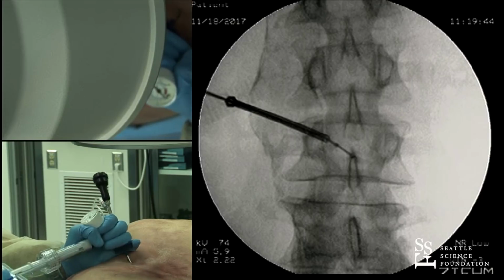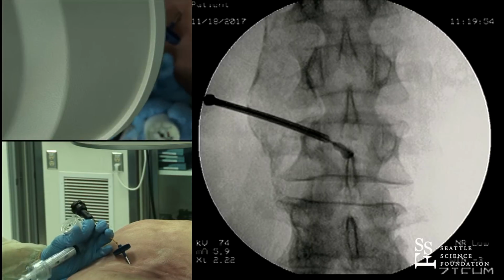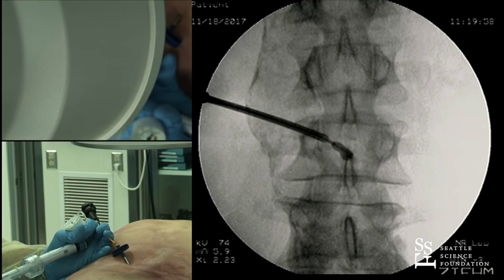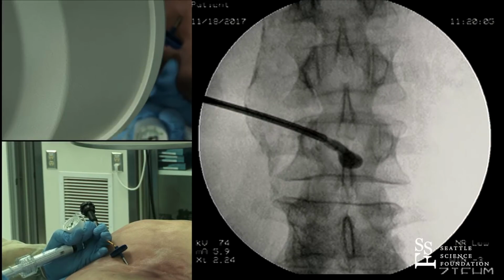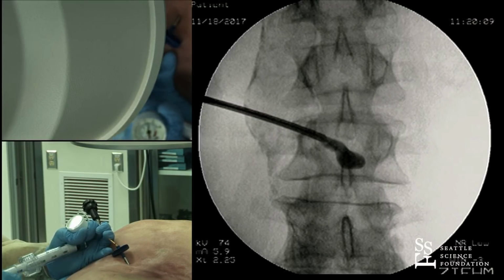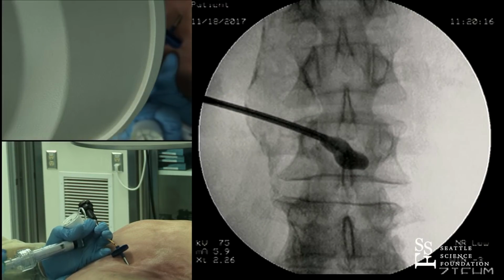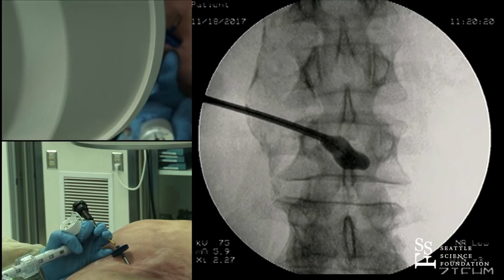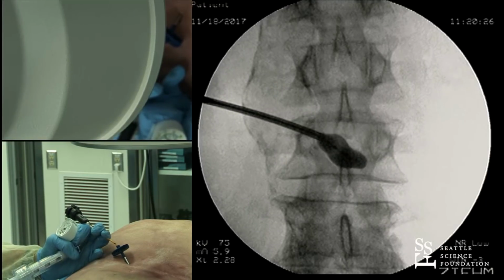And whenever you do this, you'll have to hold the balloon so it won't slip forward on you, the so-called watermelon seed type of occurrence whenever this thing blows up, and we'll get more of an inflation in the center of the vertebral body. Keep in mind, you don't have to blow the balloon up on lateral. You can blow the balloon up anteroposteriorly, and that's very nice. And you could bring it back even further if you wanted to. So we've got nice balloon inflation, we've got nice position in the center of the vertebral body. Let's save that one for posterity's sake.